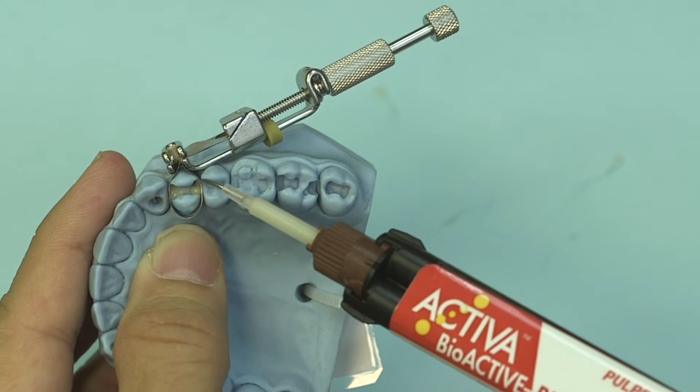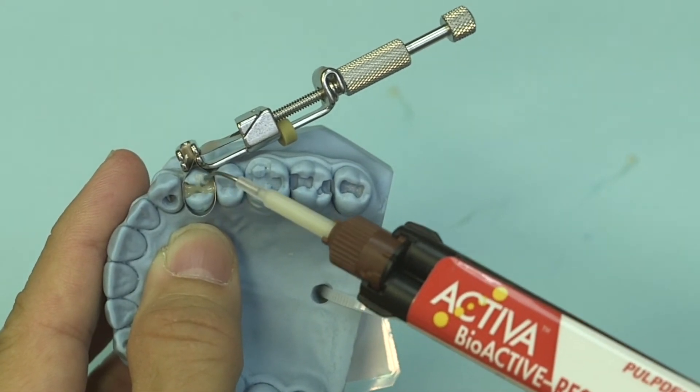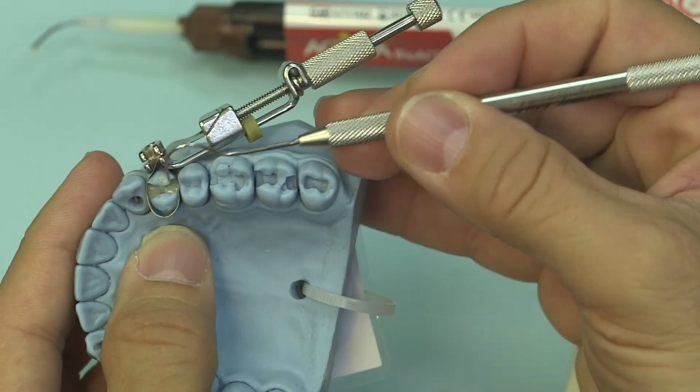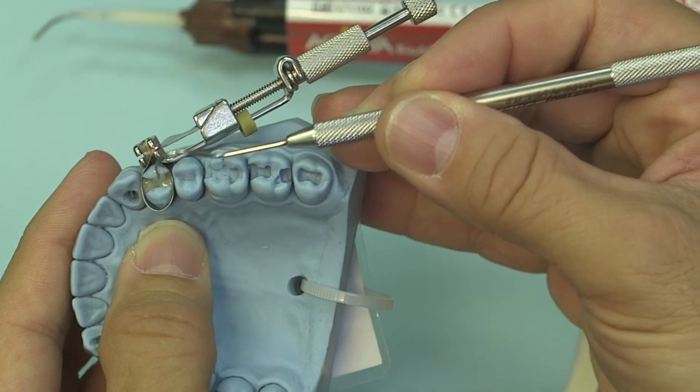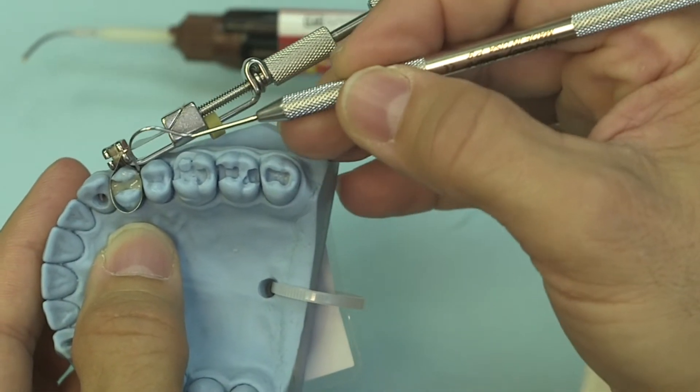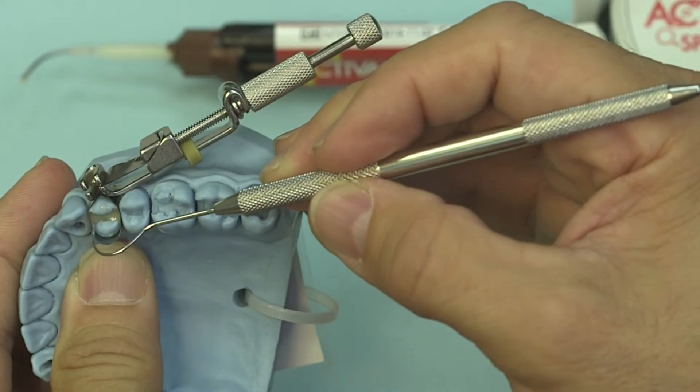Again, bringing the cannula slightly out and then bringing it over to the buccal surface area, just kind of dragging the material out that way. Now you can get rid of the excess if you would like to, and then I just like to make sure that I have everything in place.